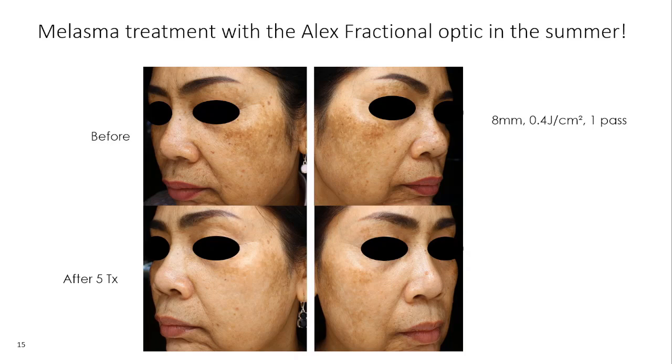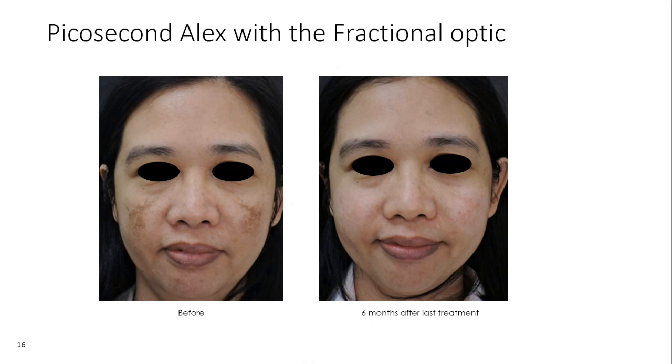Yes, you can treat with the diffractive lens array, but this was a patient of mine, 1 hertz, going very slow, it was frustrating, low energy with the diffractive lens array, it improved. This is one of Niwat Hornicorns' patients, and we actually published a paper.